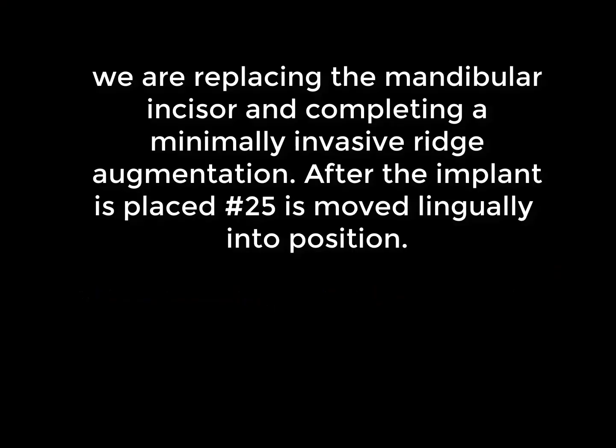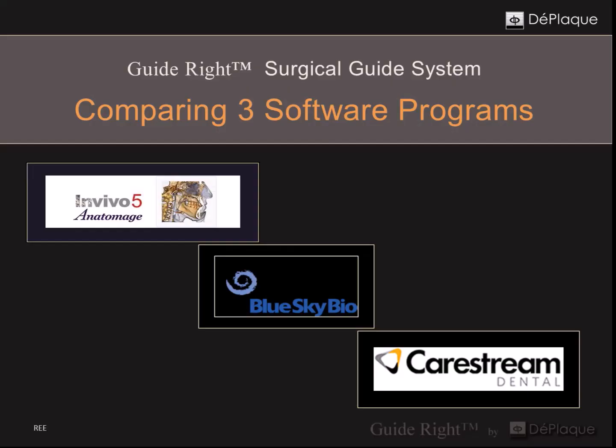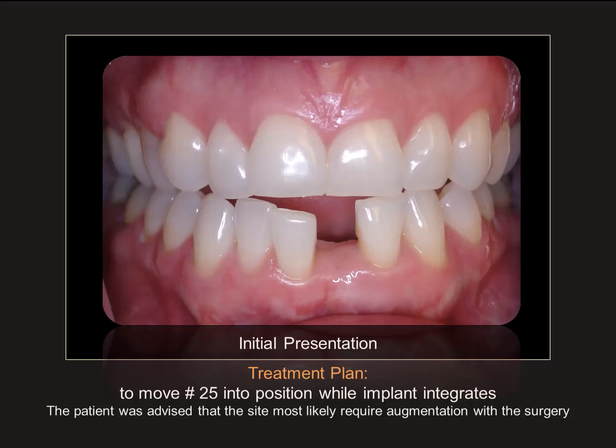We are replacing the mandibular incisor and completing a minimally invasive ridge augmentation. After the implant is placed, number 25 is moved lingually into position. We are using 3 different software programs to evaluate the implant placement. The treatment plan is to replace number 24 and reposition number 25 while the implant is integrating.